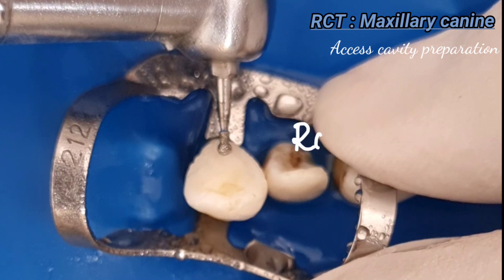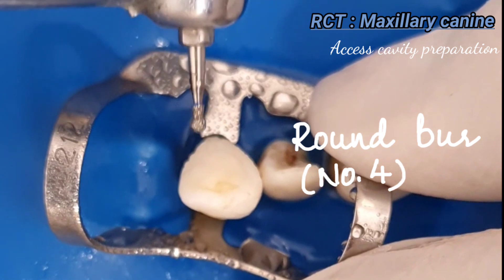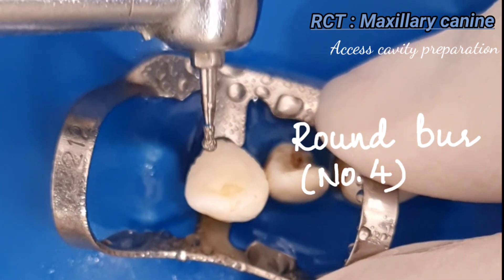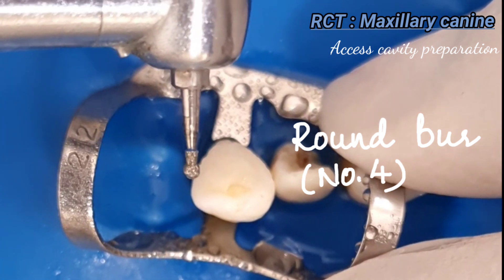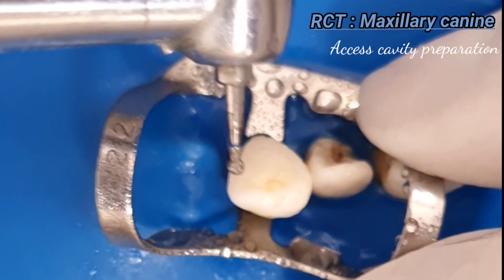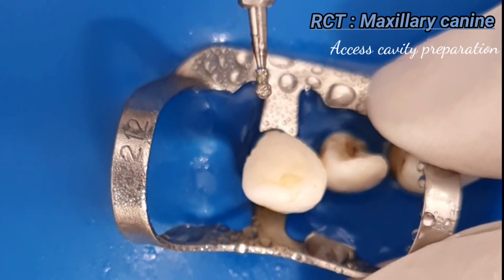Hello guys, welcome back. Today we are doing root canal treatment of the maxillary canine. Access opening for the maxillary canine is the same as that of the maxillary incisor. Enamel is penetrated in the center of the lingual surface with the help of a number 4 round bur, and the angle is perpendicular.